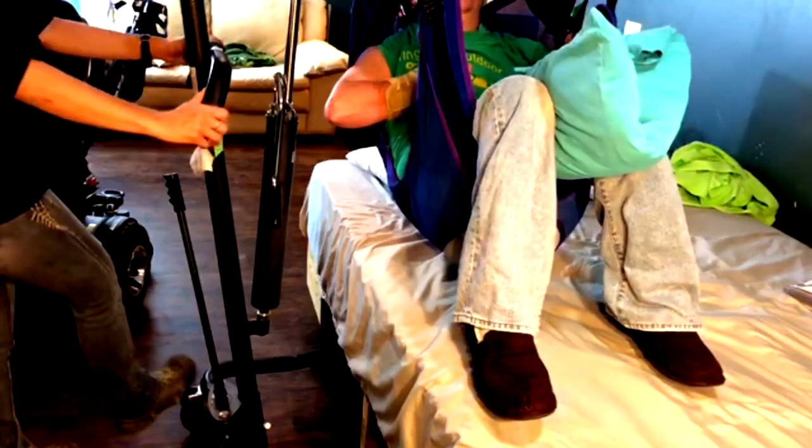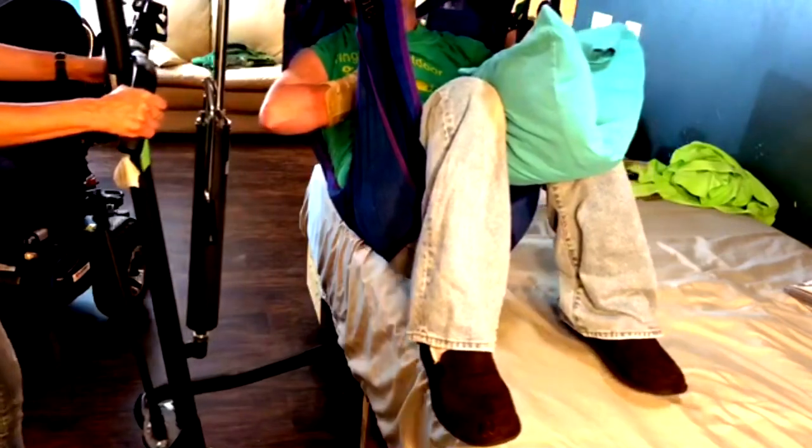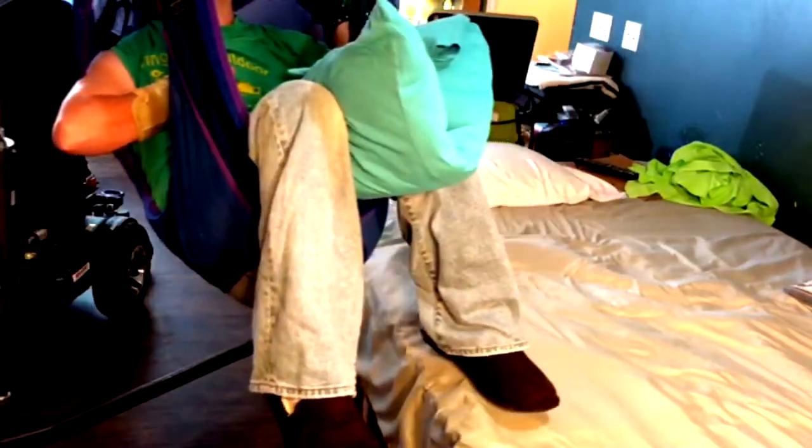I put my slippers on just to protect my feet — or my shoes, whatever I wear at the time. Then I unlock the wheels and pull the Hoyer away, using the hand grips so I'm not pulling on the sling and making myself tip over.